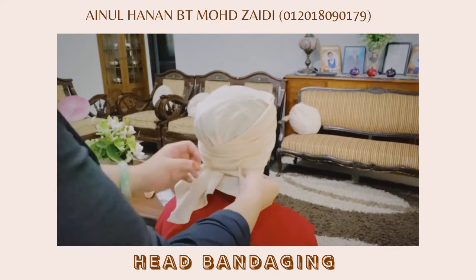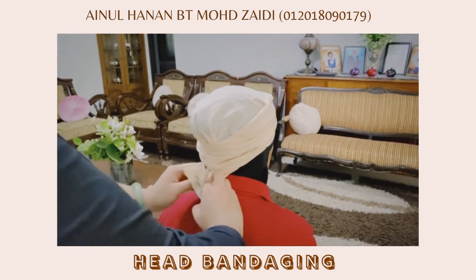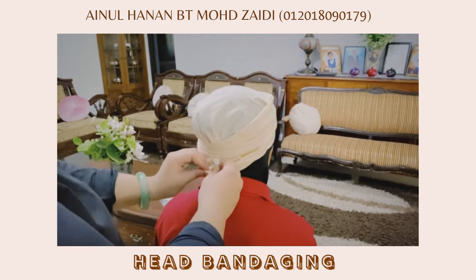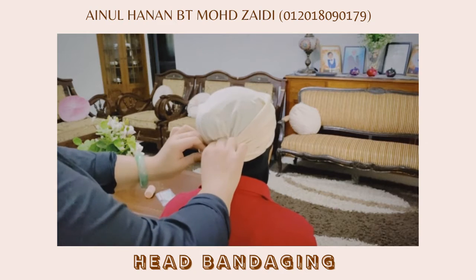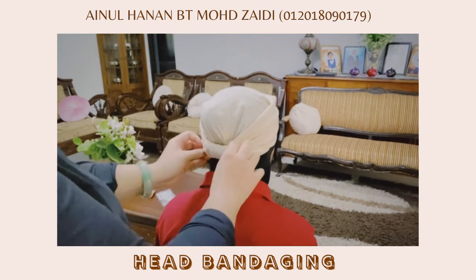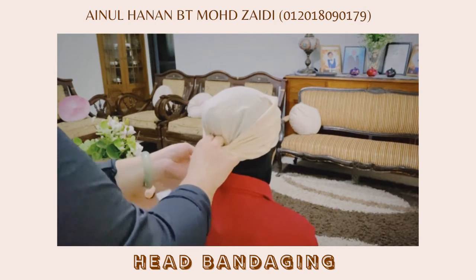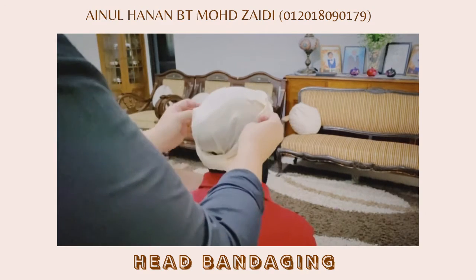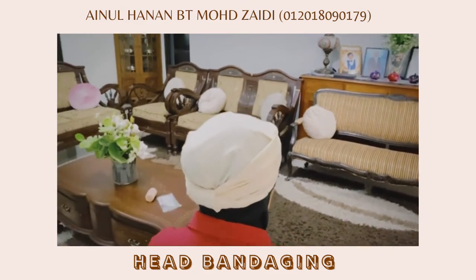And now you have to fold the end over here and place it over here. And now it should look like this.